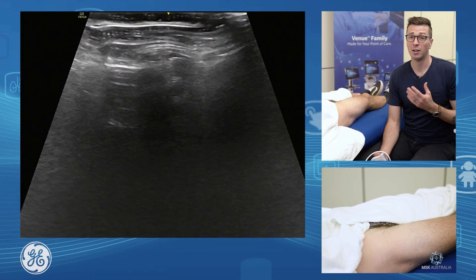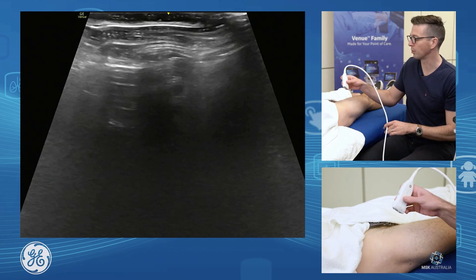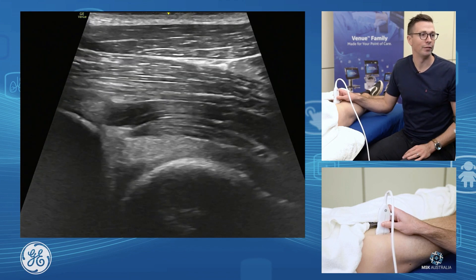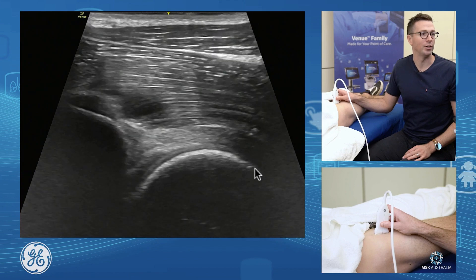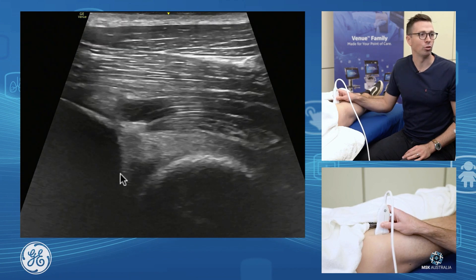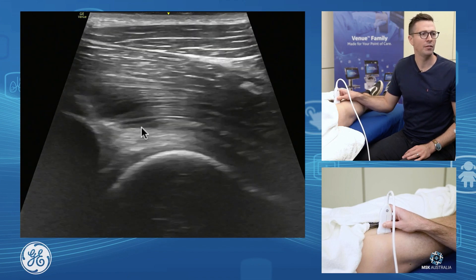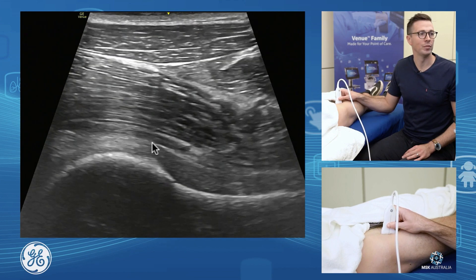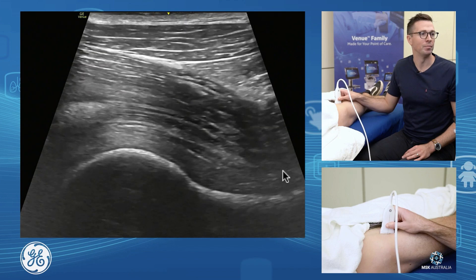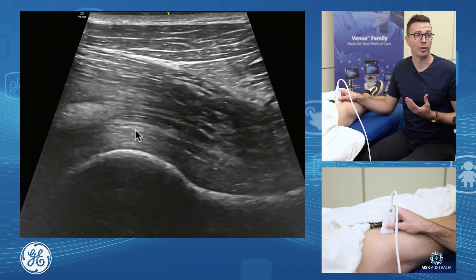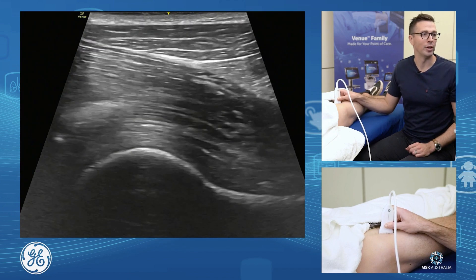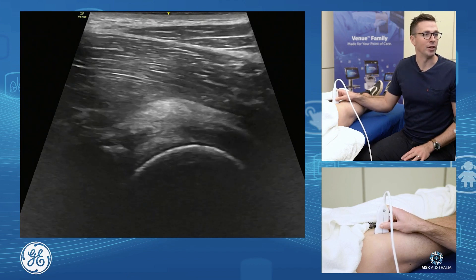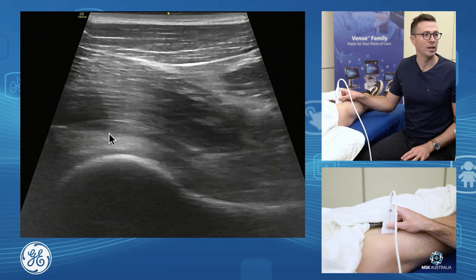Anterior hip joint assessment. First, we assess the hip joint proper. Put the probe straight on the front and have a look. We identify our femoral head, the anterior aspect of our acetabulum, the triangular shape of the anterior labrum, then scan down and assess the femoral head-neck junction. We look at the hip joint capsule — anteriorly this is the anterior iliofemoral ligament. If you have a joint effusion or joint synovitis, this is where it would be. We can also get a limited assessment of the anterior labrum and the joint itself.